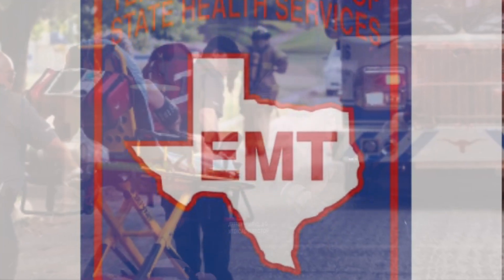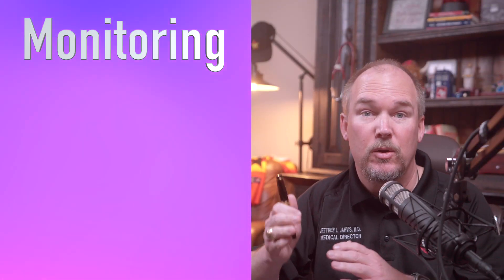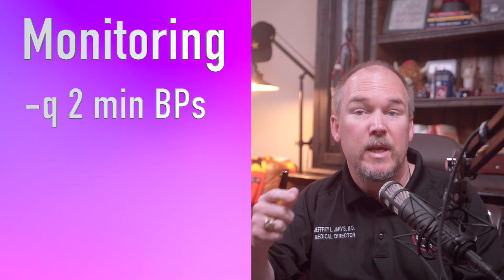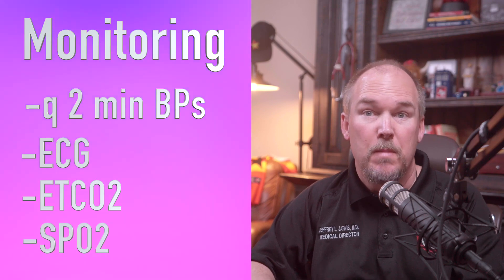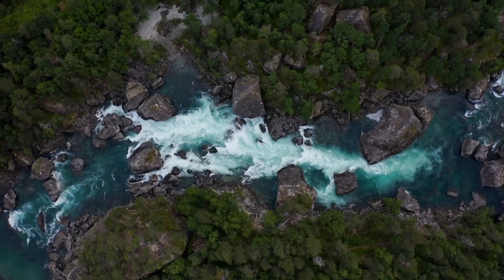Let's go through the protocol. For preparation, it's similar to any invasive airway preparation. Ensure that appropriate monitoring is in place, including every two-minute blood pressure cycling, ECG, end-tidal CO2, and SpO2. Make sure to place the pulse-ox probe on the opposite arm from the blood pressure cuff, because as it inflates, blood pressure cuffs cut off pulses downstream. As the name implies, pulses are sort of important for pulse oximetry. It is amazing how easy this is to miss — I see it all the time in the emergency department.